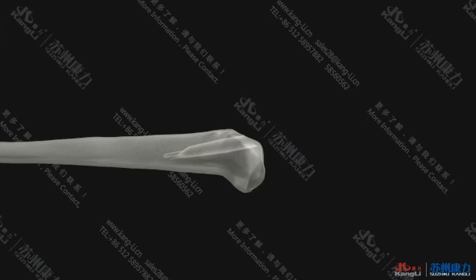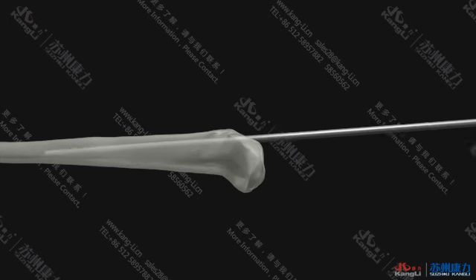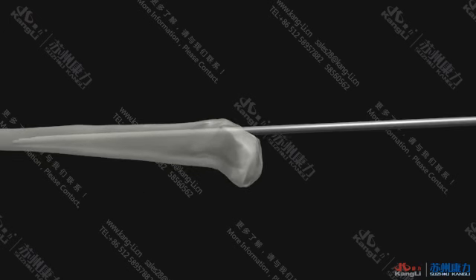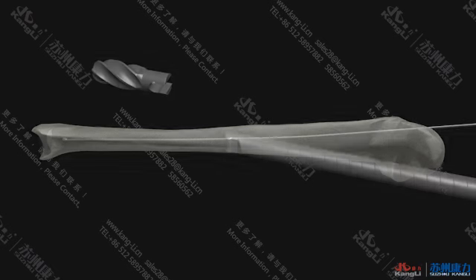Insert the guide pin introducer right through the fracture end under the monitor of fluoroscopy and by manipulative reduction. Fix the ball guide pin with the guide pin holder and insert it along the central hole at the bottom of the guide pin introducer until the ball reaches the distal side of the bone marrow cavity. Remove the guide pin holder and the guide pin introducer.